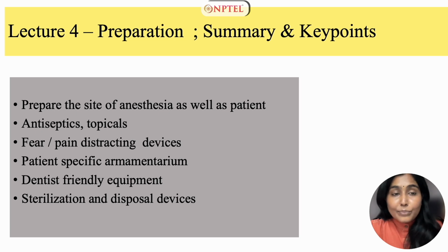With this, I come to the end of lecture 4 on preparation of the patient. Now, here's the summary. Let's prepare the site of anesthesia as well as the patient, physically and psychologically. Always remember to use antiseptics and topicals before you initiate the process of injecting local anesthetic solution into the tissues. Incorporate fear or pain distracting devices to augment the experience of painless dental anesthesia administration.